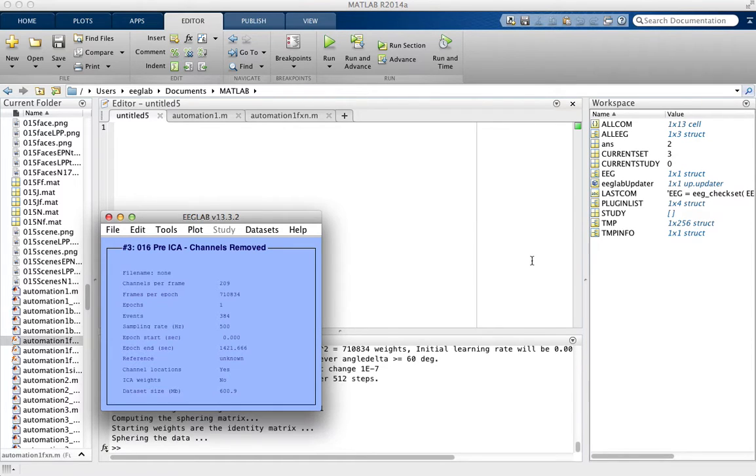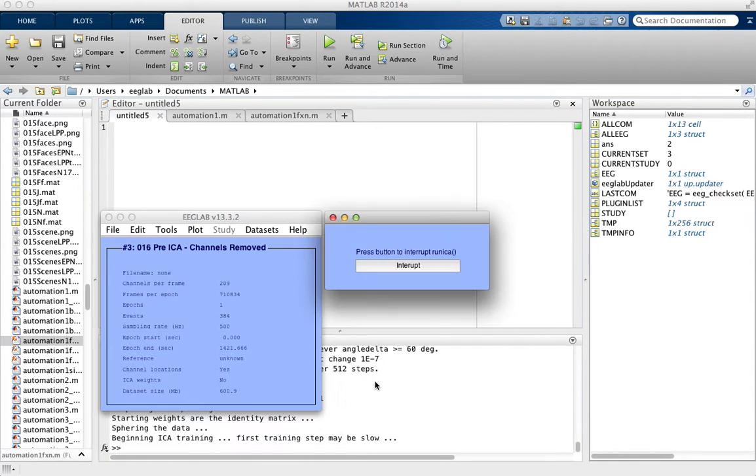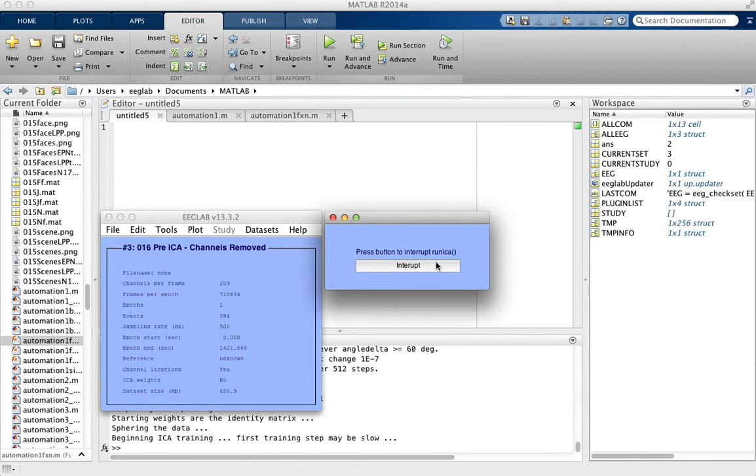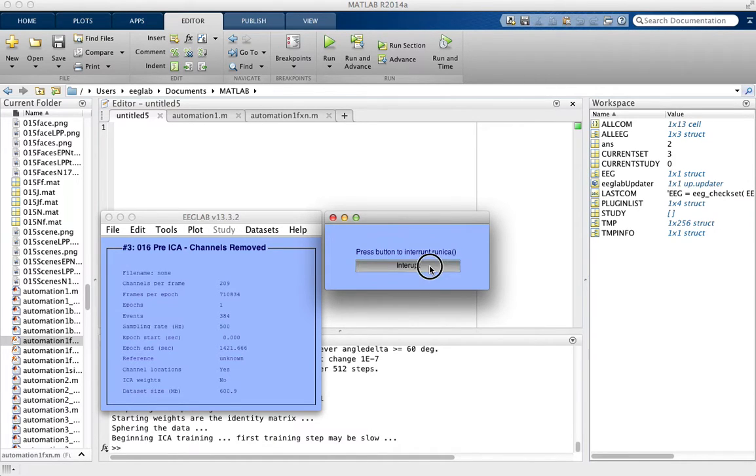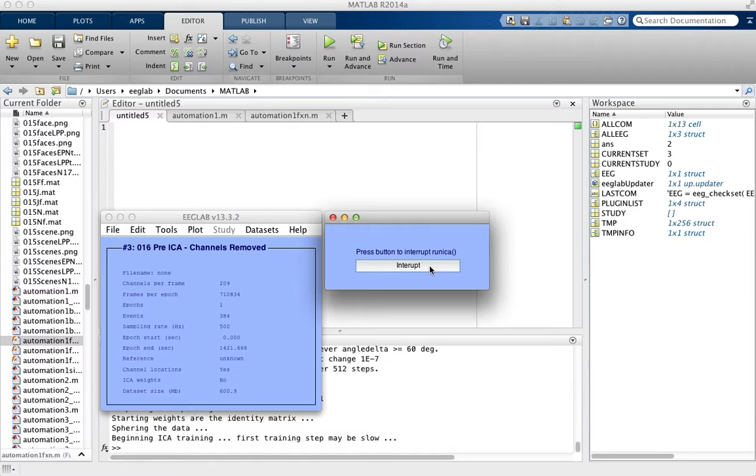If you ever decide that you want to do something else or interrupt it, you can click this interrupt button here, which will stop it. Or if this box isn't here, to interrupt any MATLAB script, you can just press Control-C.